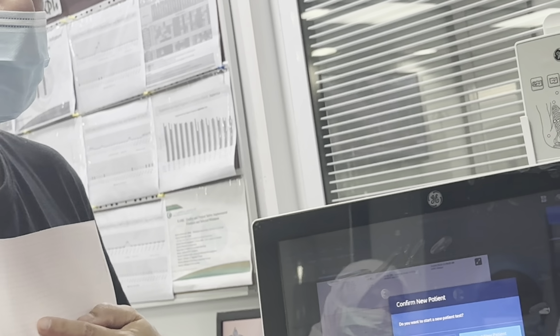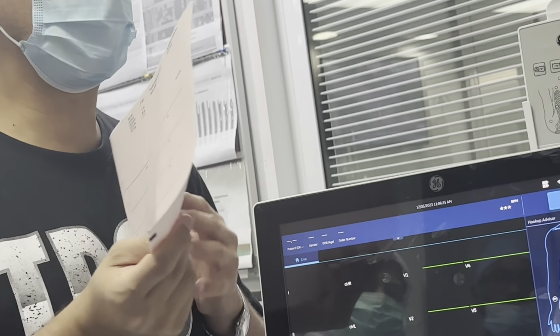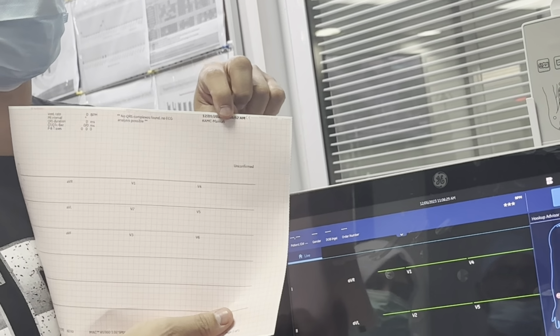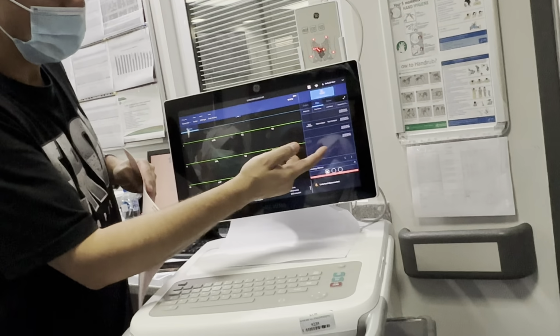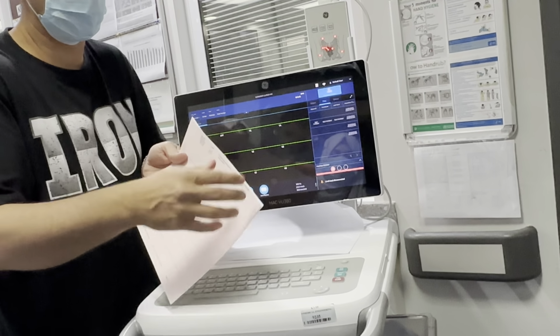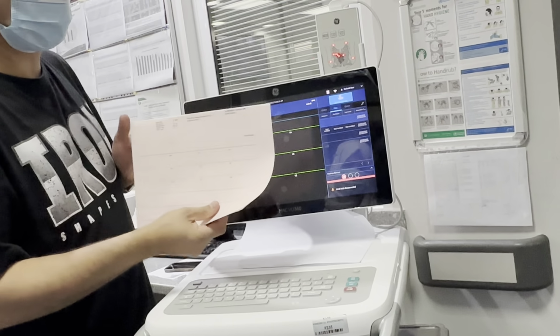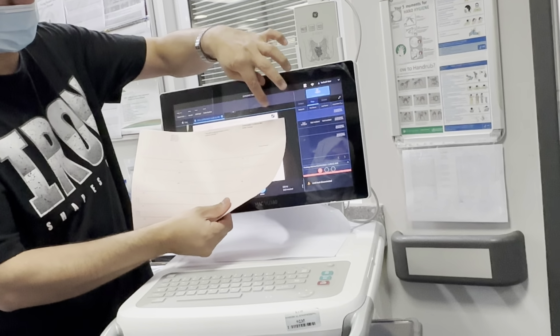My colleagues took the machine and did another ECG for another patient. So you can recognize the ECG you did by the date and time from the files here. So I have the files. Where is my report? Manual transmission. The reports that were done for an emergency, say 2 or 3. Where is my report? When you check on that one, this is the report. You can compare it with the date and time you have here. If you couldn't read it, just expand. You will find the same date and time.